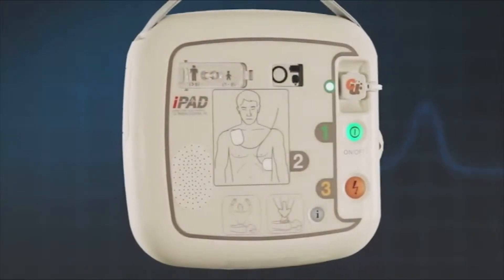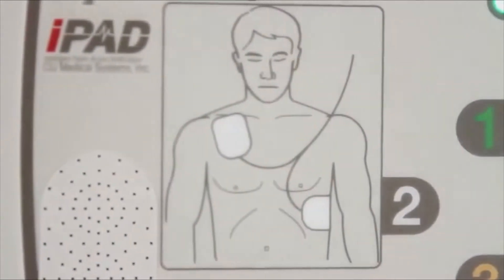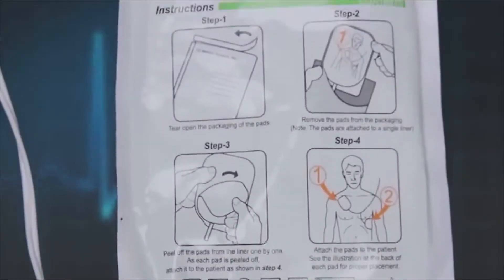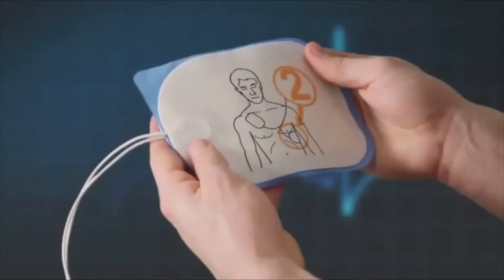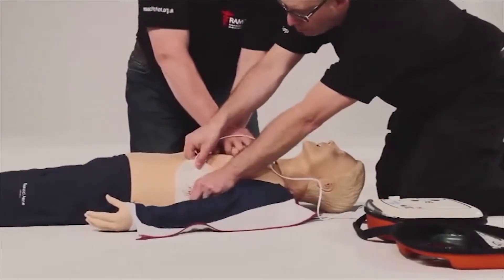The AED will then give you visual and audible prompts on what to do. Follow these instructions. The AED will prompt you to remove the pads and place them as shown on the pictures. Should you place the pads at a pace faster than the voice prompts, the iPad SP1 AED will catch up with you.